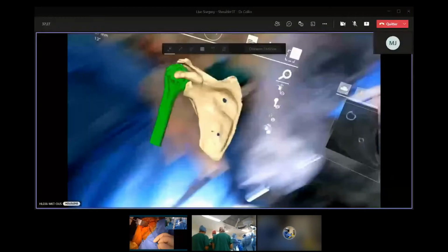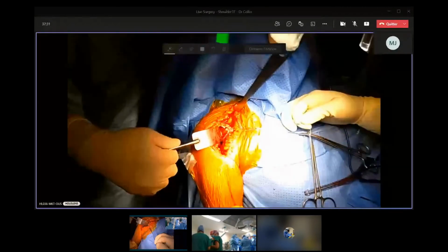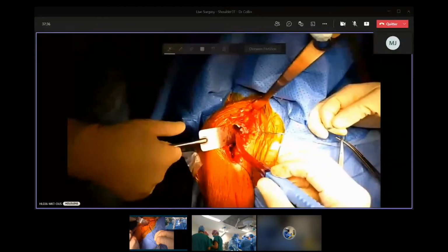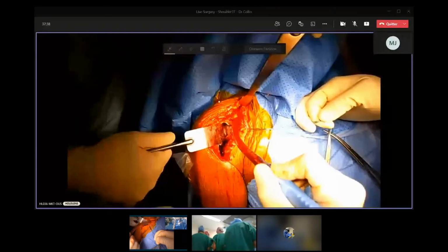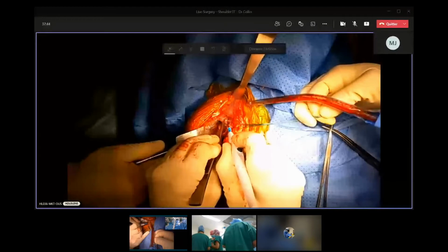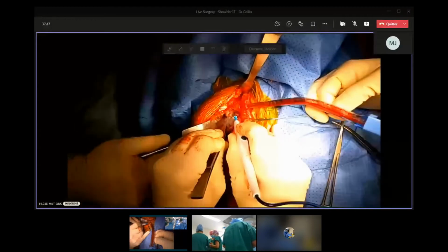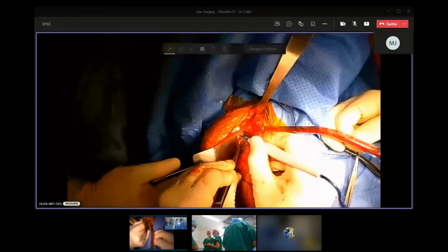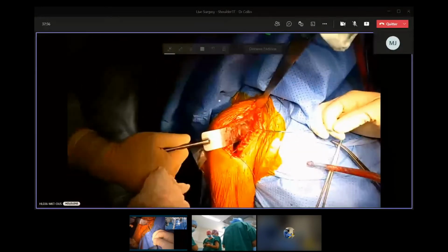In order to show you this trick, if you have younger surgeon online, this step is very, very important if you want to have a nice glenoid exposure. So what you need to do here, you need to release this under the coracoid, like this. Sometimes you have an artery here, and it bleeds. So don't worry, it's very, very frequent. And the goal, you need to prepare this as well.